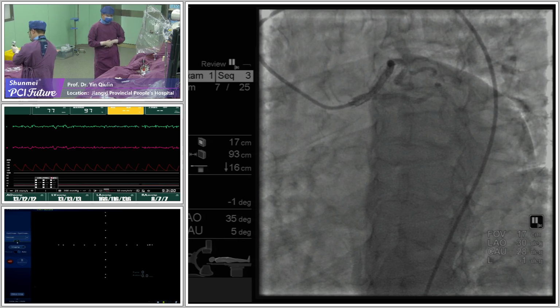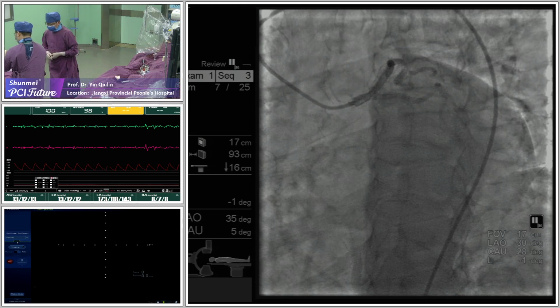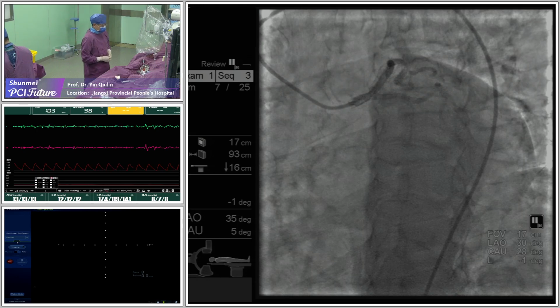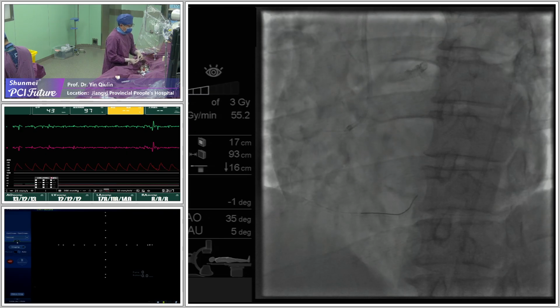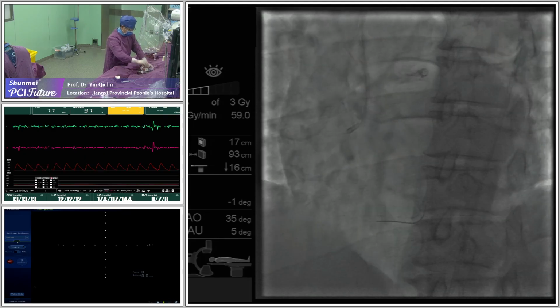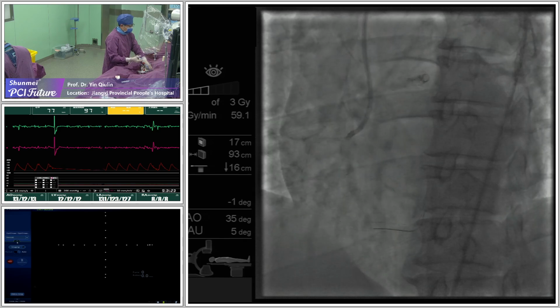So I would check for sure in RAO and take a quick shot. And when I'm inside the stent strut, I wanted to mention one non-conventional way to do it: go intra-stent with, for example, a Gladius MG, traveling knuckle with a dynamic tip load, playing with a traveling knuckle and go further.